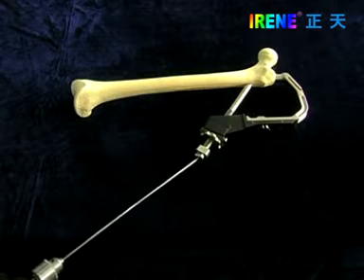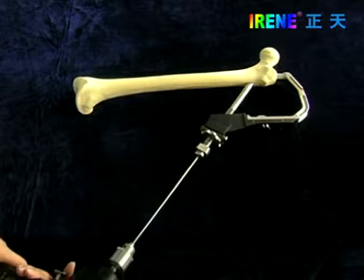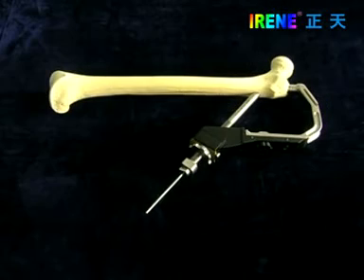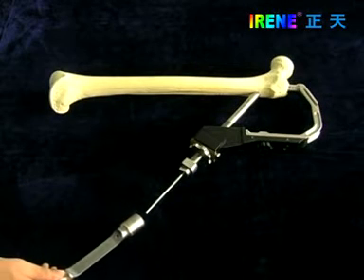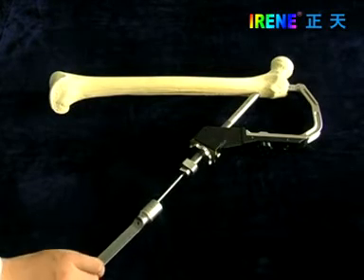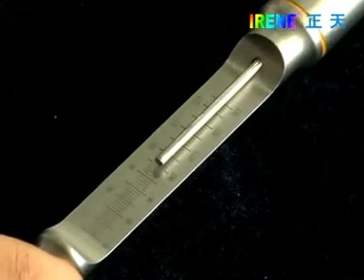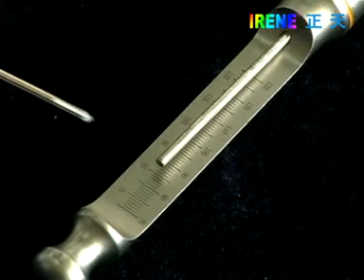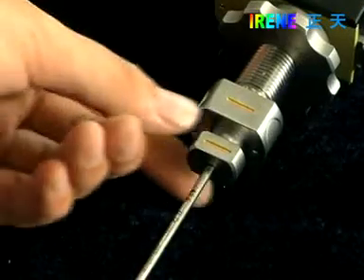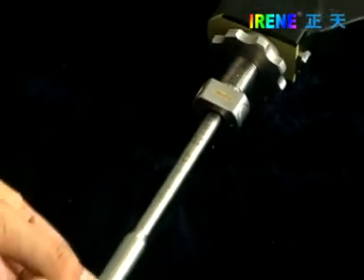Insert the guide pin and make sure it is 5 mm away from the femoral surface. Insert the depth gauge, and the number shown should deduct 5 mm. The result is the size of the blade screw that will be used. The number shown on the depth gauge is 85 mm, so the size of the blade screw should be 80 mm. Take out the drill sleeve. Leave the guide pin inside.